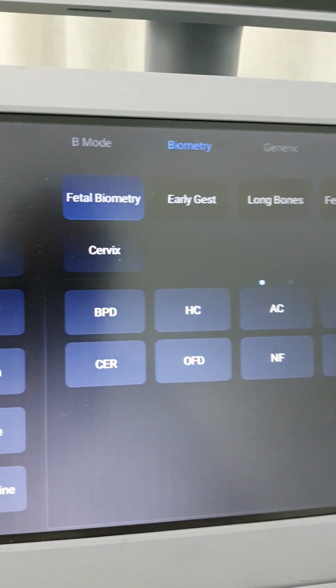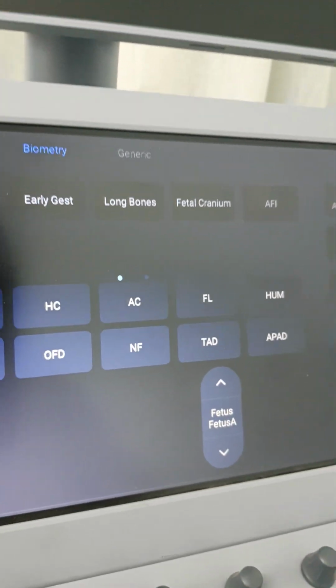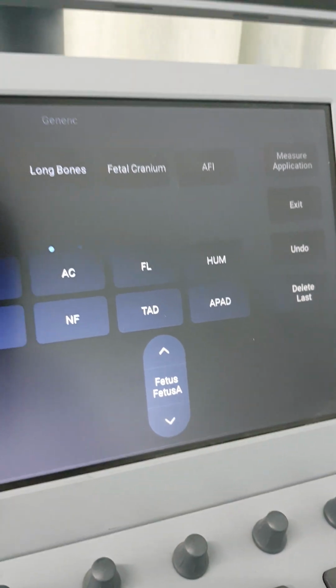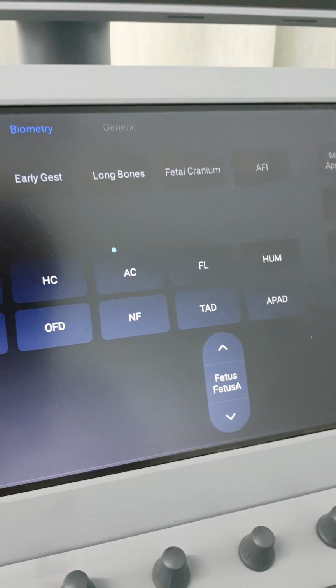And accordingly, of course, you can determine if there is intrauterine growth restriction through these graphs in a serial ultrasound scan, or if there is macrosomia, for example, or if there is abnormal weight or abnormal growth of these fetuses.